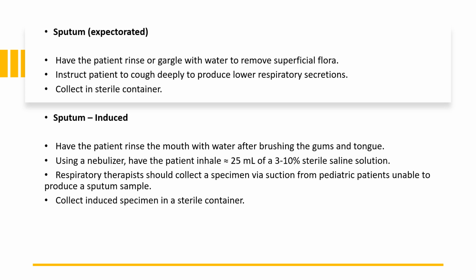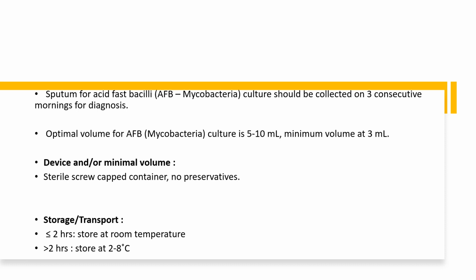Respiratory therapists should collect a specimen via suction from pediatric patients unable to produce a sputum sample. Collect the induced specimen in a sterile container. Sputum for acid-fast bacillus culture should be collected on 3 consecutive mornings for diagnosis.